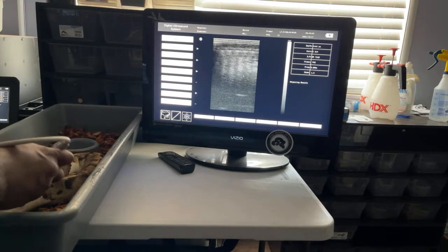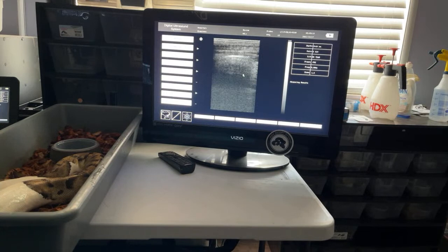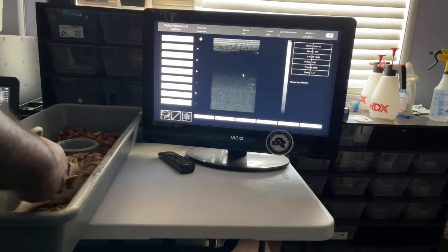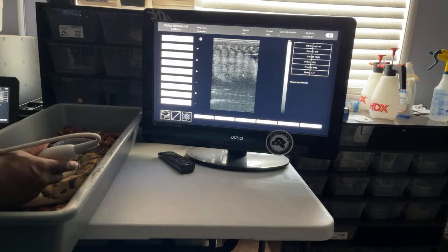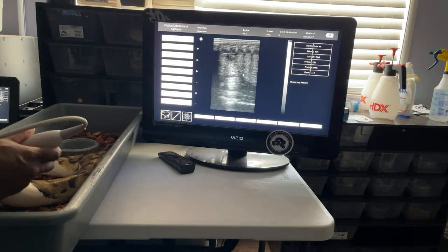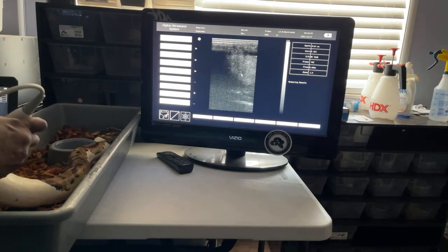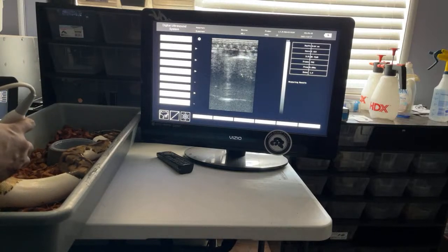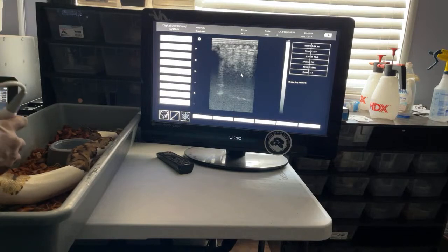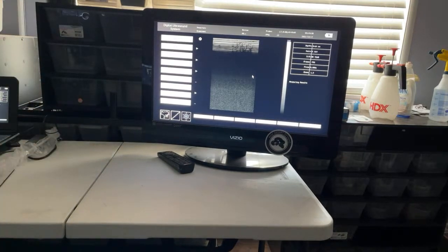And these big old cloudy white spots are eggs. They're still jumbled up pretty tight because she's coming down from her ovulation. So egg, egg, another egg, eggs, eggs, eggs. Everybody's got eggs. You gotta know that reference, 5 points. Yeah, see that? See the curve? So she got about 6 or 7 in there. Just enough to piss me off and hit some bad odds.